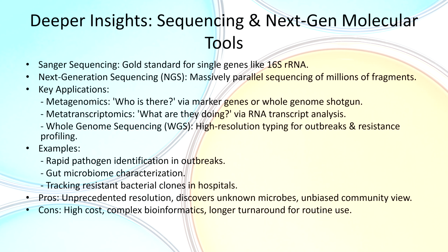These techniques give us unprecedented resolution and can discover unknown microbes, but they can be costly, require complex bioinformatics, and have longer turnaround times.